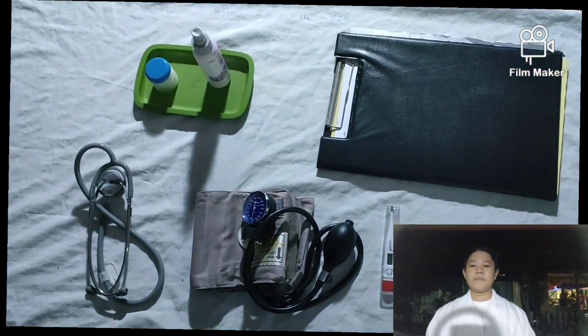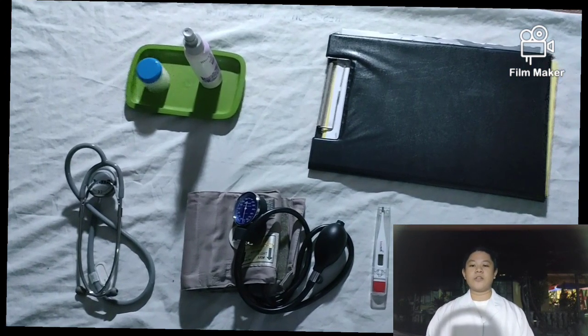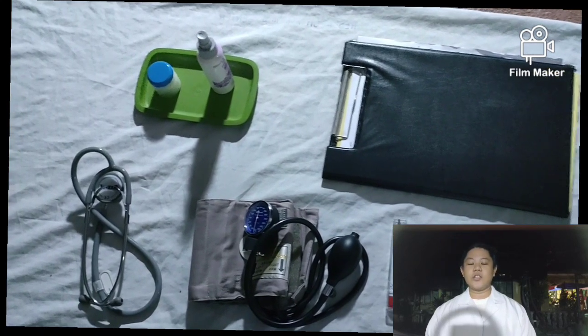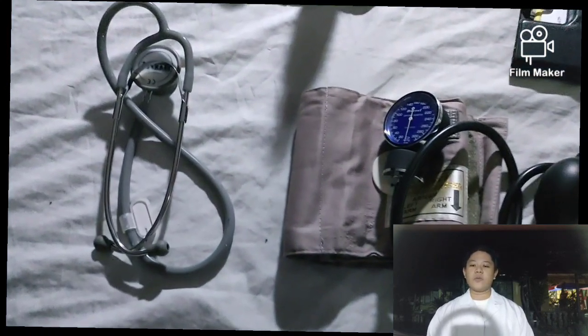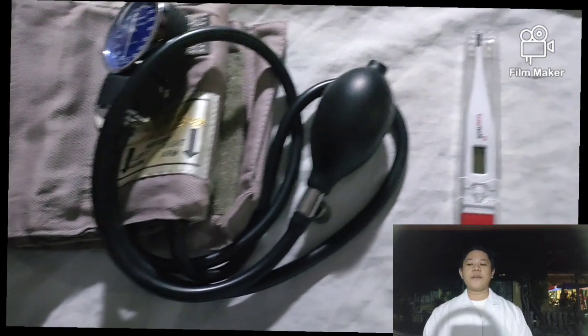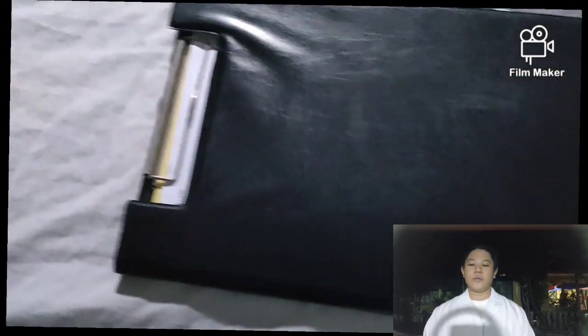Planning. Assemble the necessary equipment and supplies: thermometer, sheet or cover, disposable gloves if necessary, tissue wipes or cotton balls, watch with second hand or indicator, stethoscope, blood pressure cuff of the appropriate size, and sphygmomanometer.